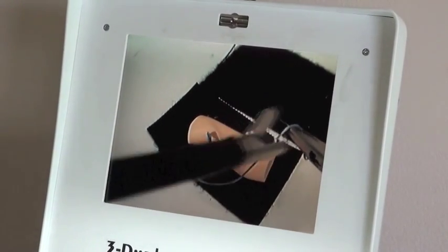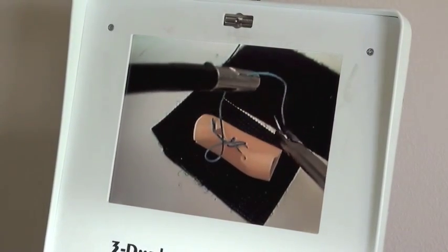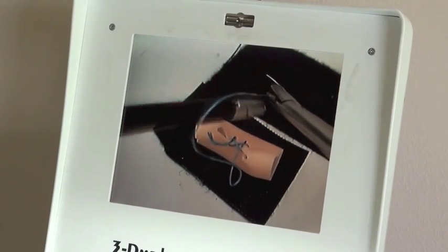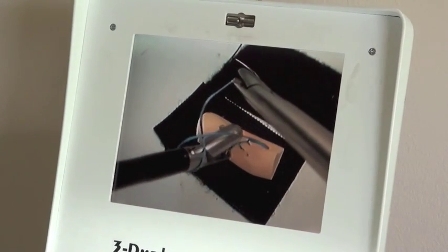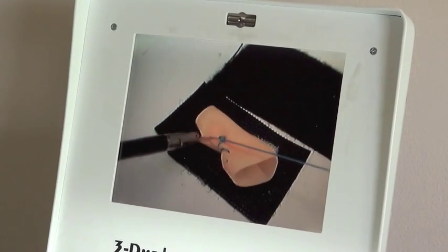I'm ready to go again. Again, I'm going to go to the stiff part here. Nice and parallel. And I'm going to do another wrap. Go down together as a group. Grab my tail. Pull down.